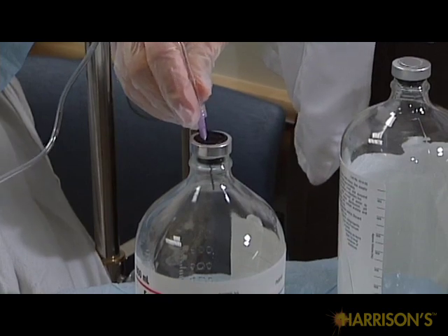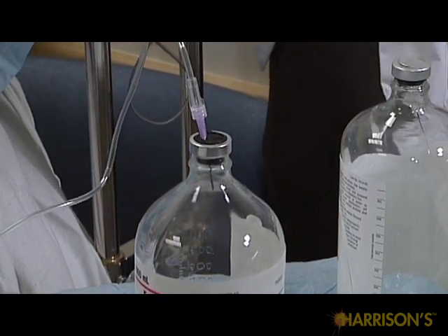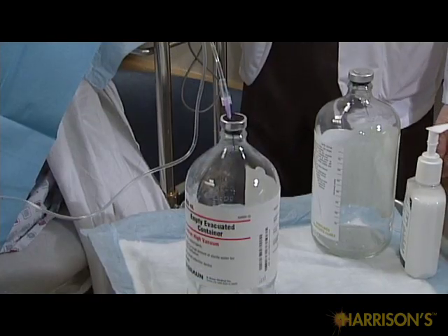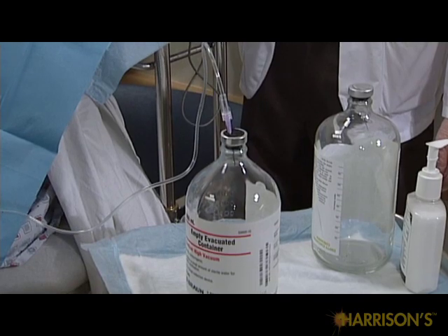Hand the 14 gauge needle on the other end of the tubing to your assistant to place into a 1 liter vacuum sealed container. If you prepared the tubing with the roller piece properly, you can still control flow through the tubing with sterile technique even after you've handed the needle off.